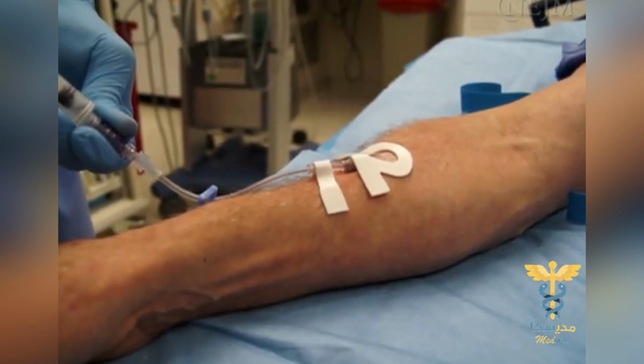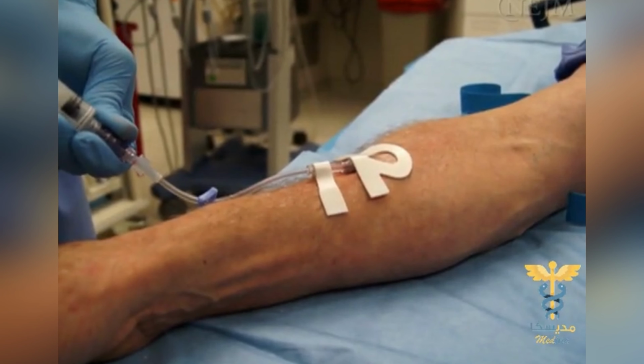The flush should flow smoothly into the catheter. If there is resistance, the catheter may be kinked, occluded, or outside the vein. Look for signs of extravasation, such as pain, swelling, or blanching.